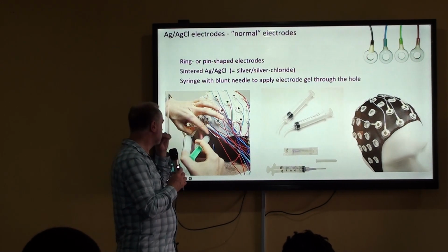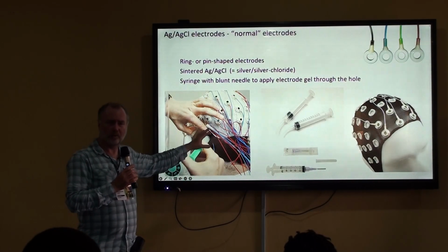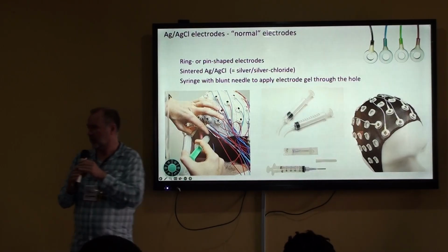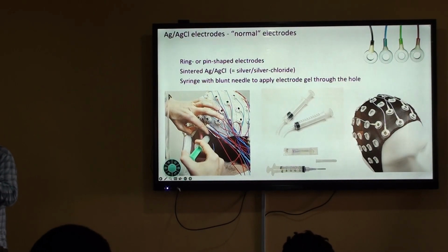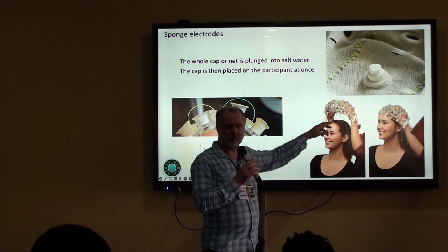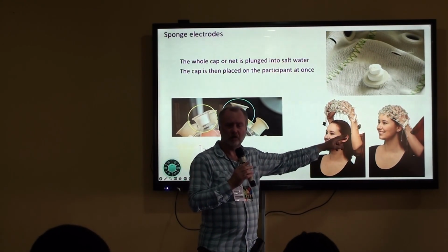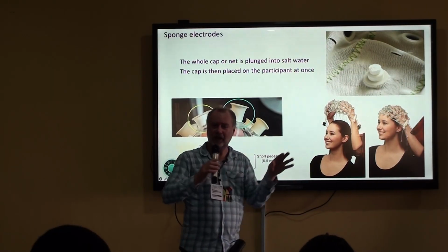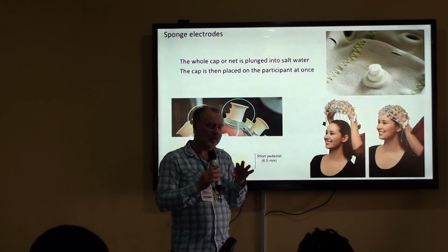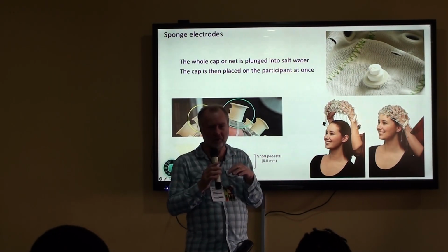I would still say this is pretty robust. This is not too difficult to explain. If I think about this system, if I would have to explain to my mother how to put this on, like a person who doesn't know anything about EEG, I think it would be likely that she would use either too much salt water or too little.